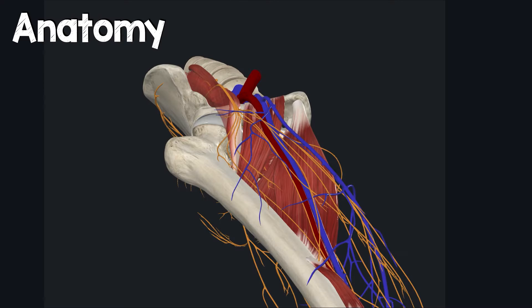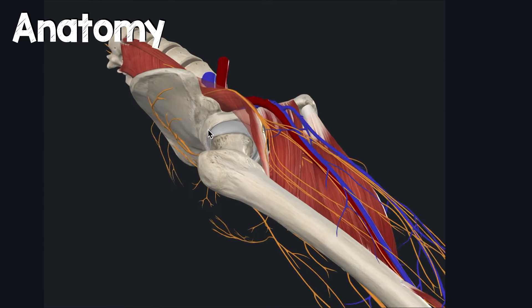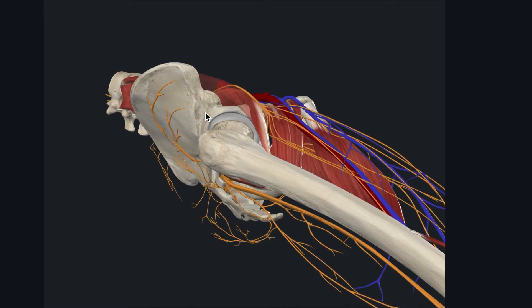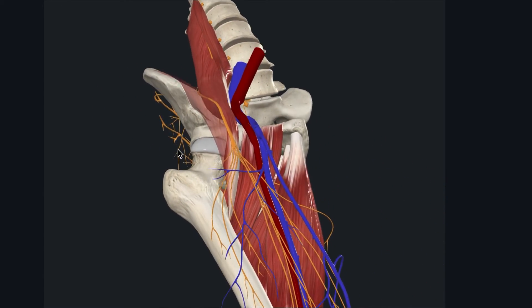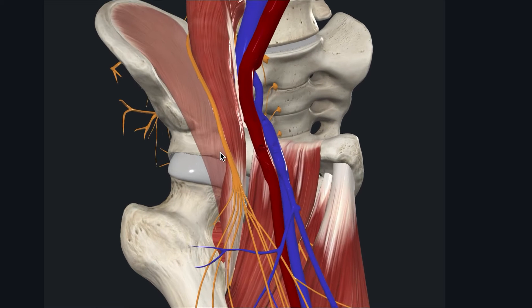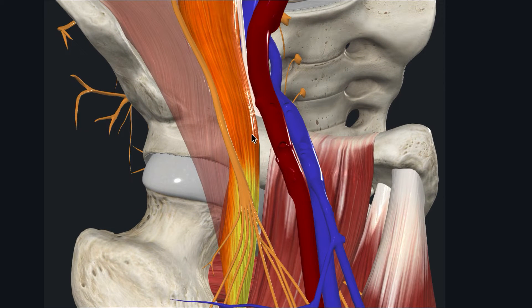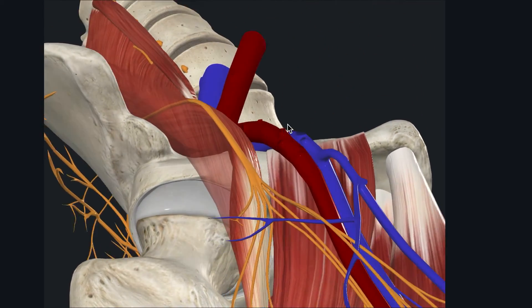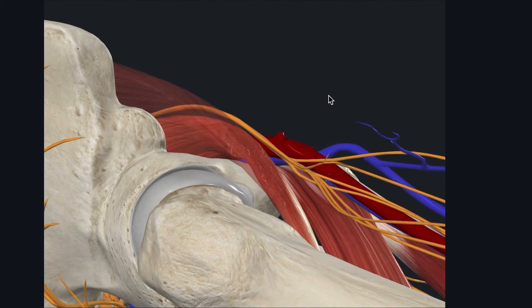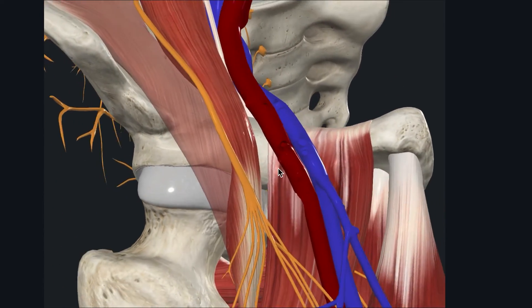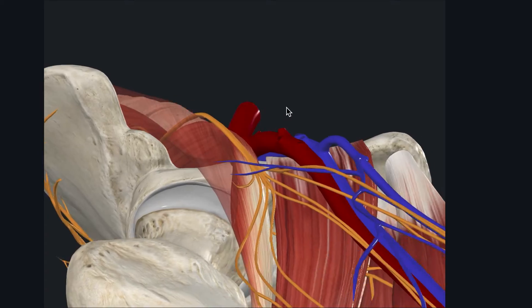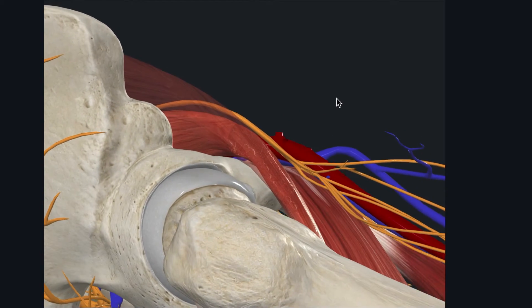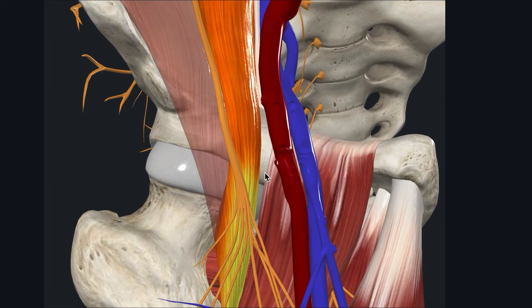Let's look at the anatomy in more detail. We can see the anterior superior iliac spine and the anterior inferior iliac spine, then around to the hip joint and the superior pubic ramus. The psoas muscle and psoas tendon lie right in contact with the superior pubic ramus, and the faded-out muscle is the iliacus. You can see the close proximity of the femoral nerve to those two muscles. A PENG block in this area may catch all of the nerve branches relevant for anterior hip innervation.